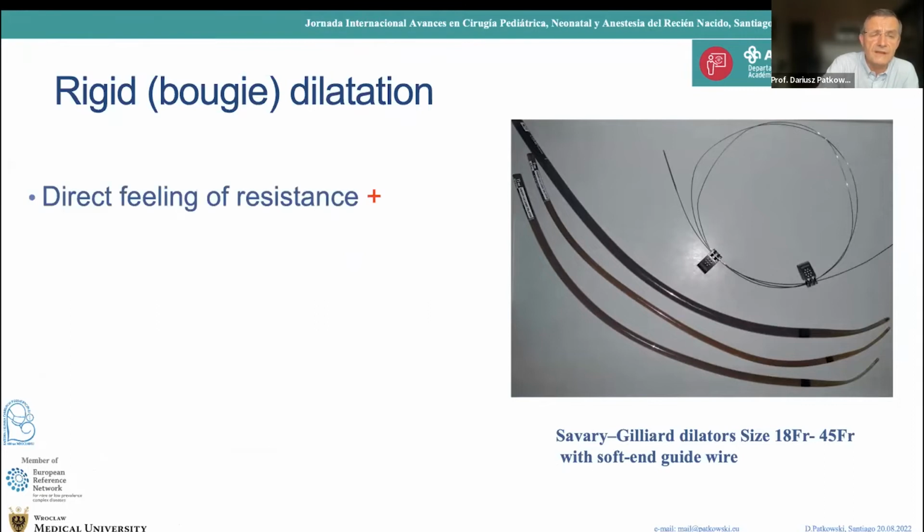I will show you. What are the positive values of rigid dilatation? You have a direct feeling of resistance. With experience, you can feel how hard the stenosis is when you pass the dilator down. Also, it's very cost effective because dilators are reusable, so you can use them for many, many patients.